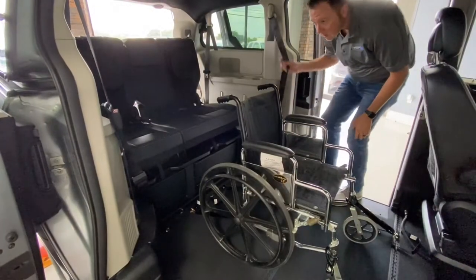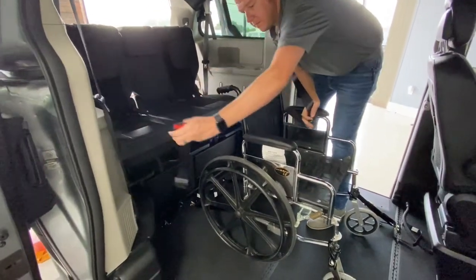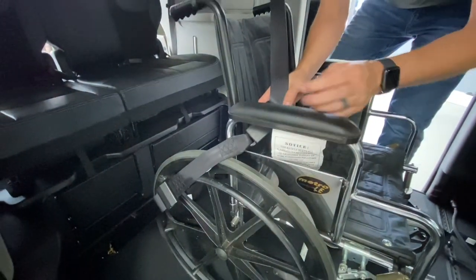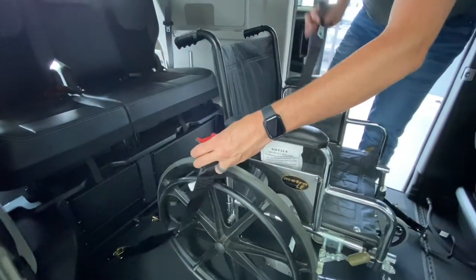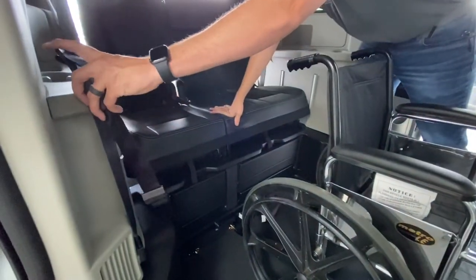You will always still use the factory seat buckle, shown here in the center row. This is also just an example, as all wheelchairs, power chairs, and people are all different. It is recommended to store the buckle up out of the way for entering and exiting the vehicle.